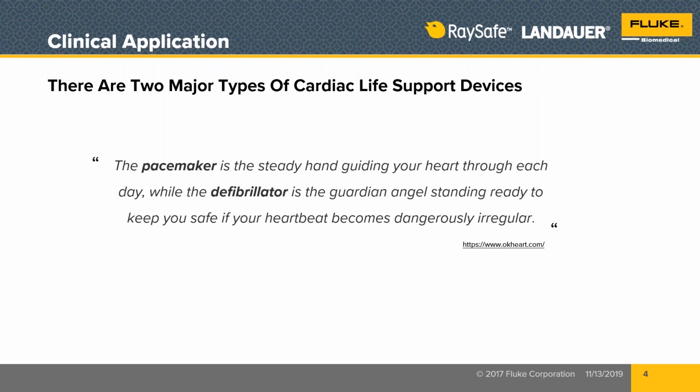These are not just instrument only devices. These are part of a more inclusive therapy or treatment for the patient that includes medications that get delivered in order to help the heart, if it's beating too slow, to be a little bit more excited so that the pacer really helps. So you wouldn't normally pace flatline or asystole. That wouldn't normally happen.